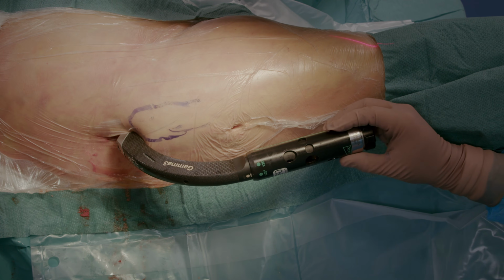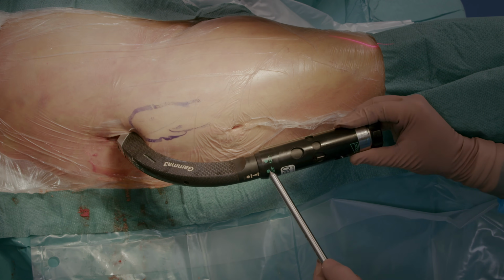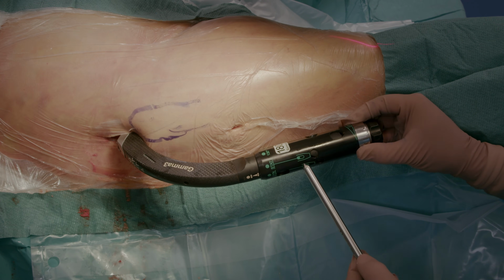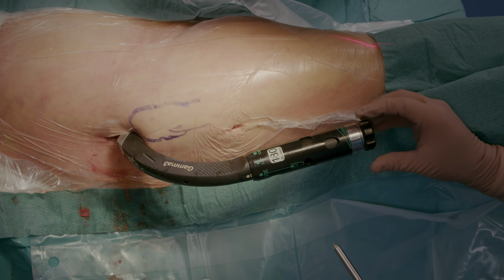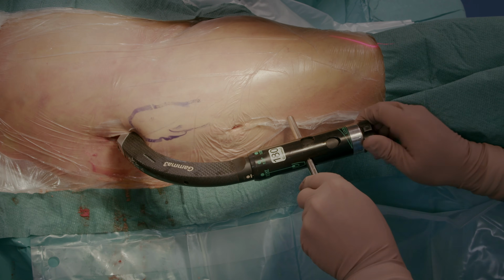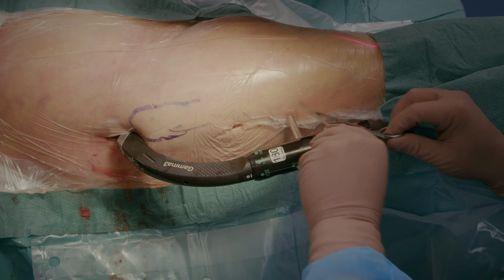Now, when turning the speed lock sleeve, we see the different neck angles and the selection of locking screw options, which are static or dynamic locking. In fracture settings, we usually select the static locking option. The guide sleeve is used to localize the skin incision site. We advance down to the bone surface bluntly with scissors.